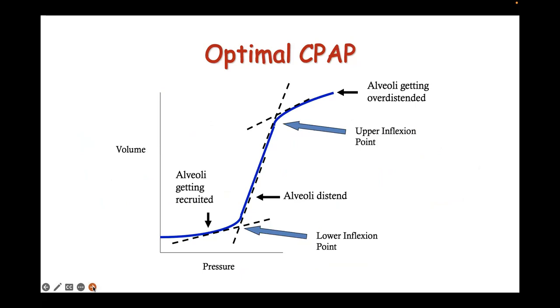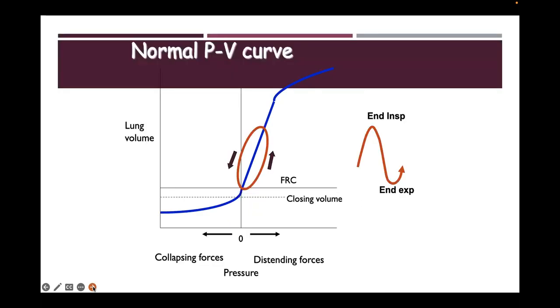Also, the pulmonary vascular resistance has a U-shaped curve with respect to the lung expansion. That means if the lungs are either less expanded or overexpanded, the pulmonary vascular resistance is going to increase, thereby reducing blood supply to the lungs and causing hypoxia, thus initiating a vicious circle of hypoxemia and acidosis. So the normal pressures in clinical practice range from 4 to 8 centimeters of water.